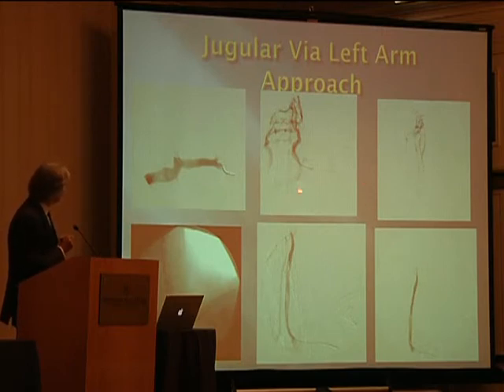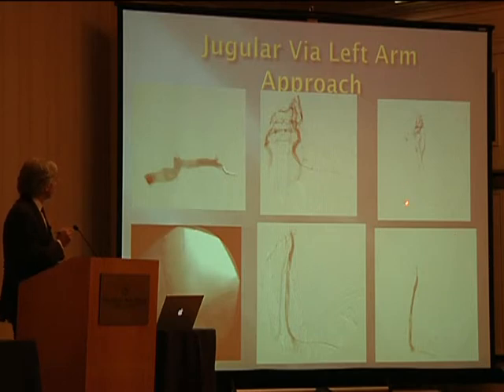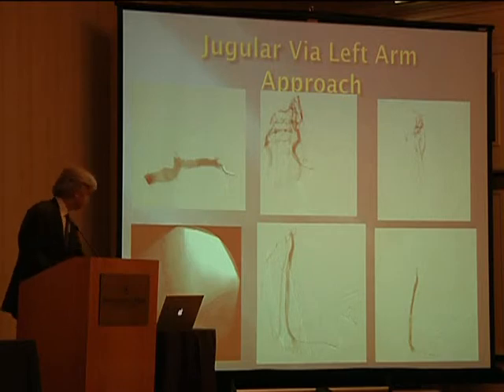And here you see the catheter coming from the arm. In this case, there was a very stringy, thready jugular vein with narrowings throughout, especially at the origin. And it came off at sort of this reverse curve, on the same trunk as the thyroidal branches. From the left arm, I was able to easily get into the vein and ballooned basically the whole thing. There were large segments of stenosis in the upper and lower portions, and we ended up with a reasonably good result.